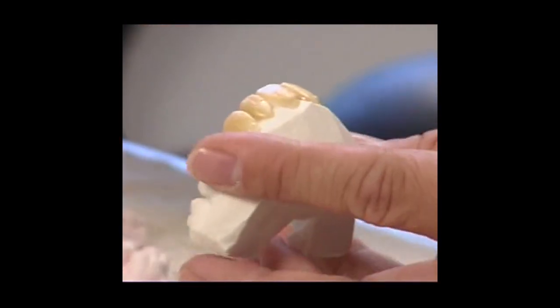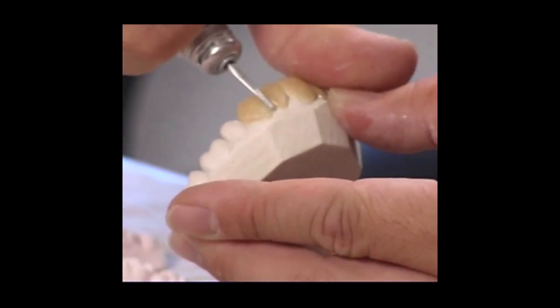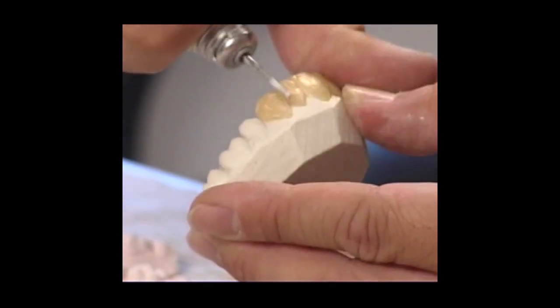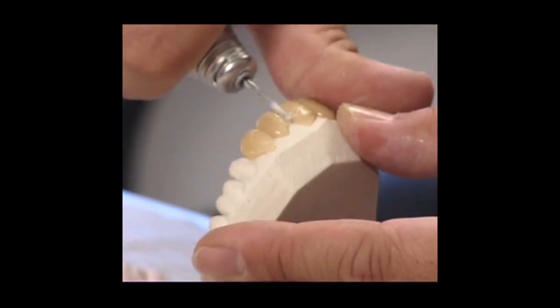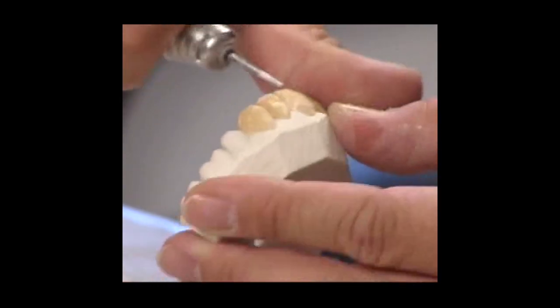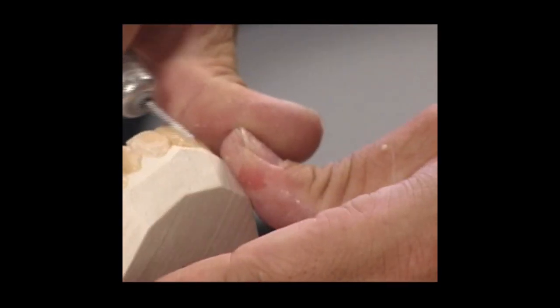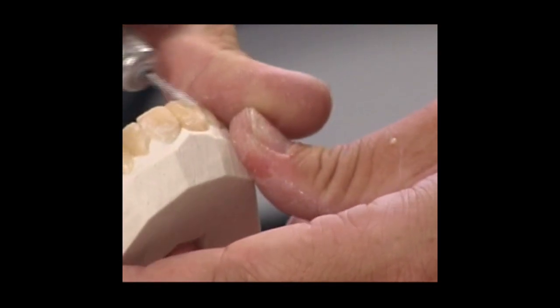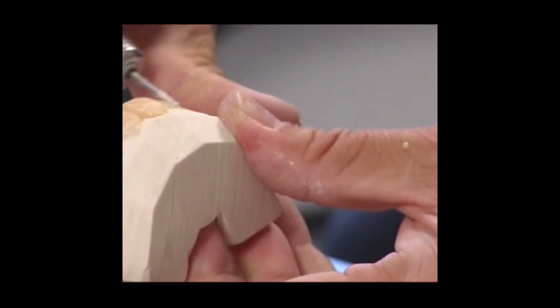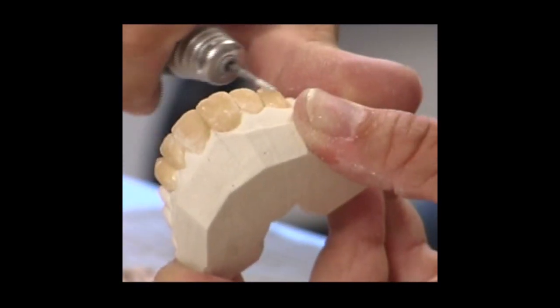You don't have to really touch the surface, but if you see any rough surface that you want to be smoother, you can use the carbide or diamond to just go over it, make the surface a little bit smoother, so your temporary will come out nice and easy and smooth also. I'm using the straight handpiece. We should have a low speed. It's easier to handle. Maybe you are accustomed to using the high speed. It's okay to use that also, as long as you make the surface just smoother. It will do the job.